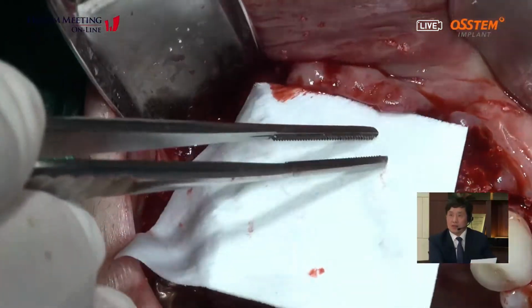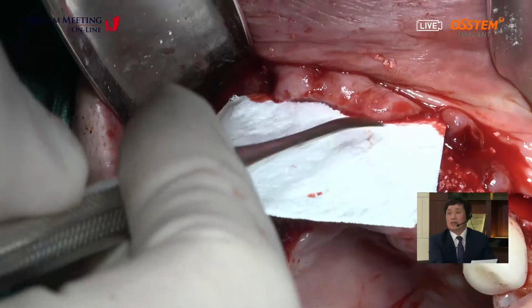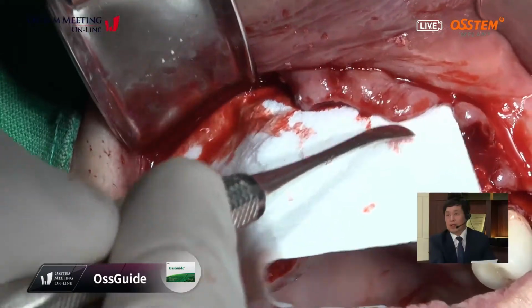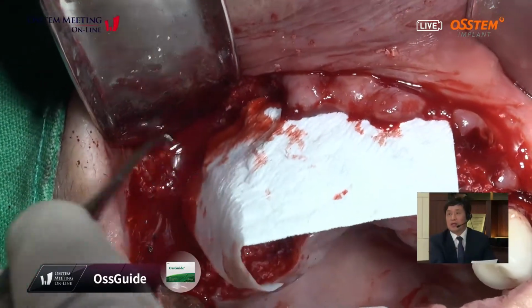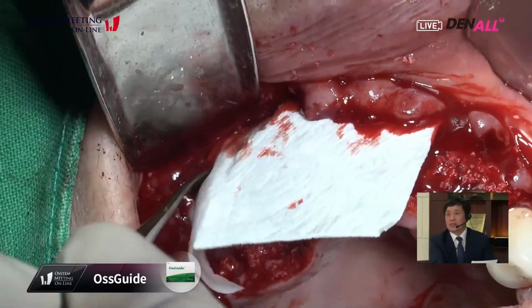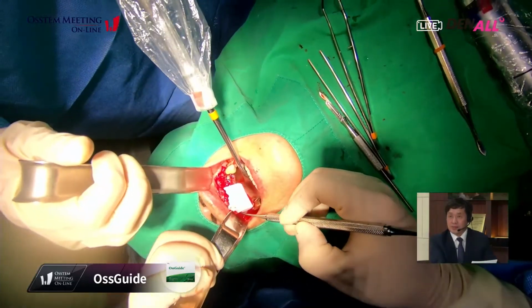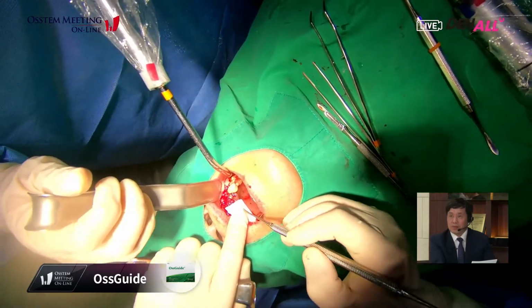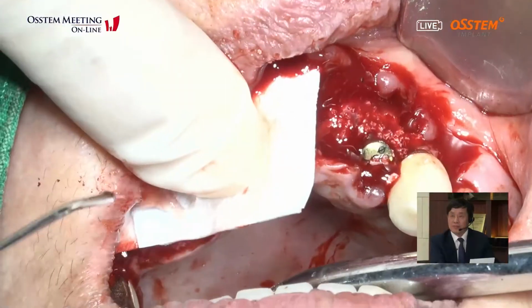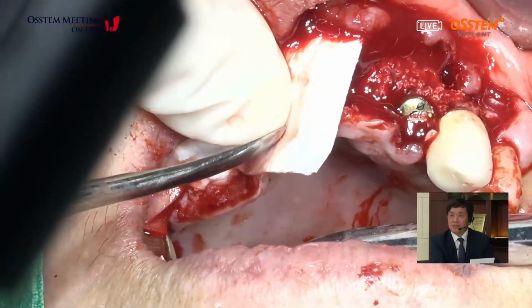Yeah, this is the resorbable collagen membrane, applied overlying the Ossbuilder. With this collagen membrane, I will cover the entire graft material. As shown, this patient has a very thin gingiva biotype. So to prevent the Ossbuilder exposure during the very early healing period, this collagen membrane coverage over the Ossbuilder is quite good.